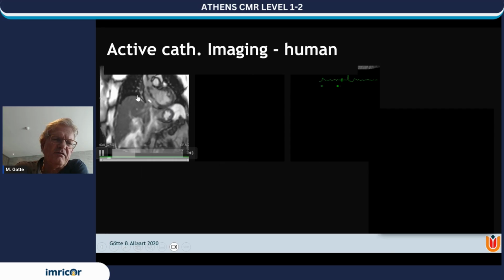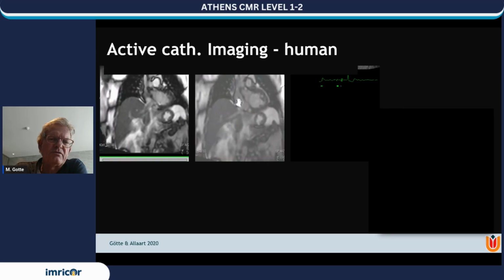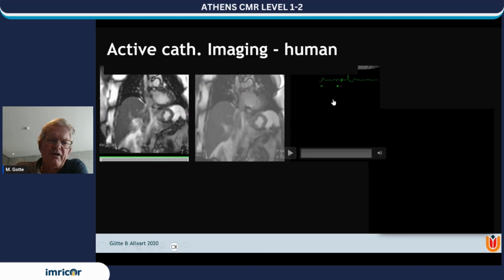And here you see how we maneuver the catheter, how it is positioned. It's not clearly seen on the images, but we were able to modify the signal strength coming from the 2 coils. So we know exactly which coil is the most distant coil, or what is the proximal coil, which is mandatory for the operator to understand in what direction he is pointing with his device. This is a way how we did it.